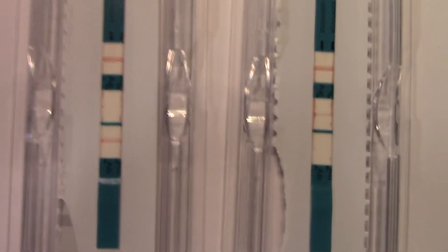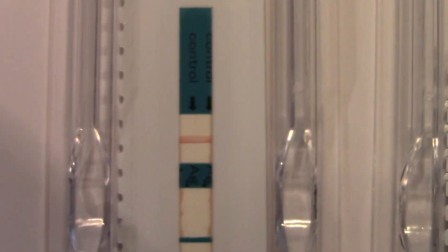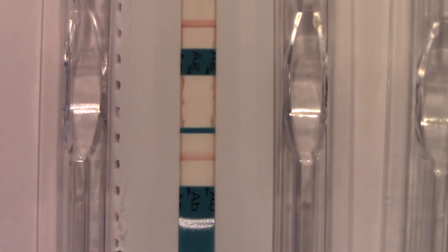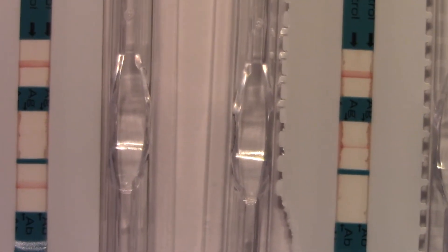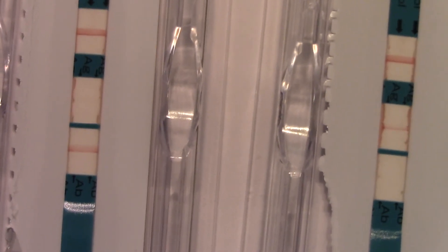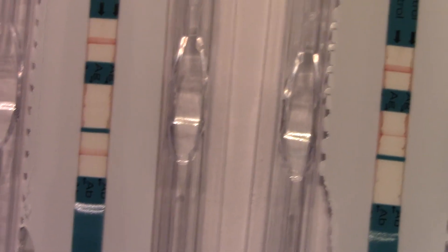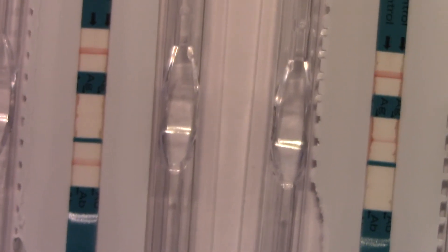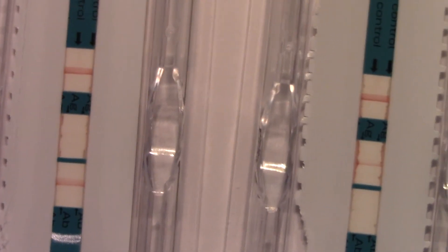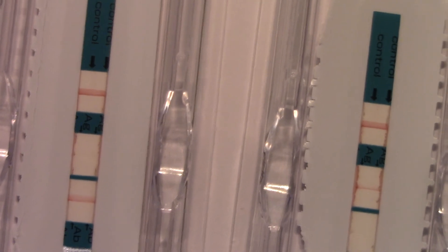On the left is our specimen that's detecting whether or not we have antibody — and it does. On the right, instead of detecting antibody, we're detecting antigen. So specimen number one has antibody — what does that mean in terms of the process for this patient? Specimen number two has antigen. Both are valid because the controls are also present.